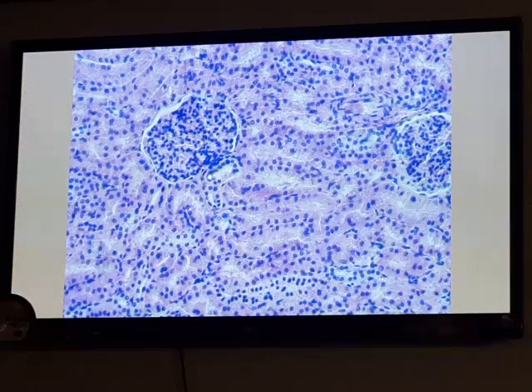The cells of the distal convoluted tubule are modified. We can see the nuclei darkly stained and closely compact together. In addition, the JG cells of the afferent arteriole form the juxtaglomerular apparatus. But what is required is only the macula densa. The JG cells we cannot distinguish on the slide; they need a special stain.